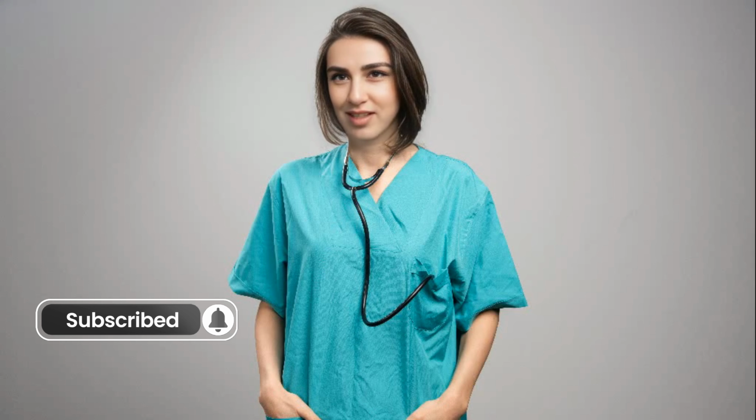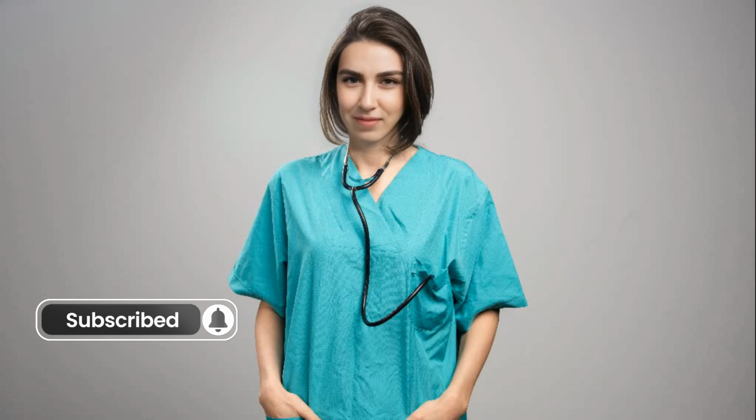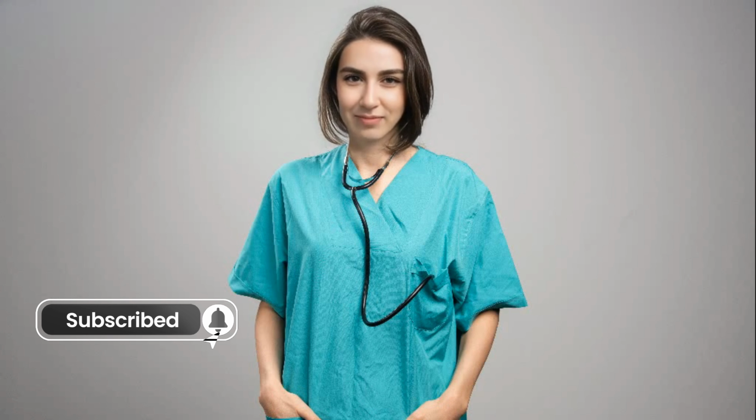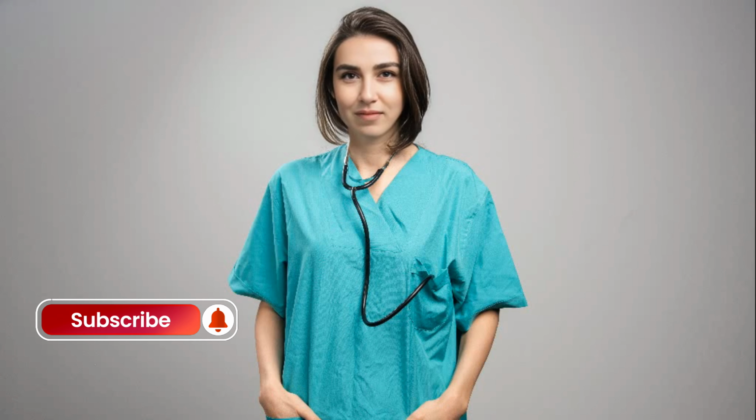While angioplasty is highly effective and has a high success rate, it is not always successful in every case. The procedure successfully opens blocked arteries in approximately 90 to 95% of cases. However, several factors can affect its success. Factors affecting angioplasty success. 1. Severity and type of blockage.